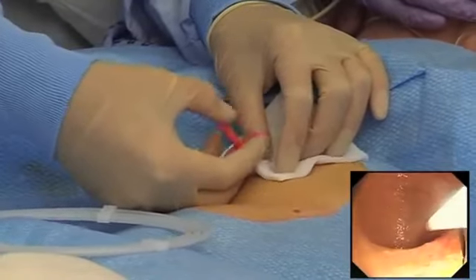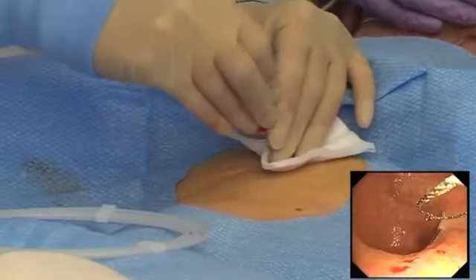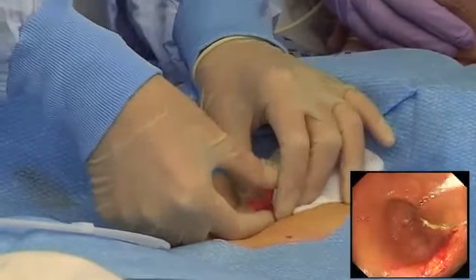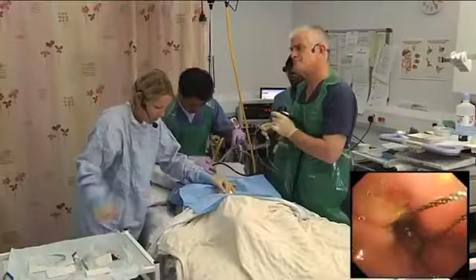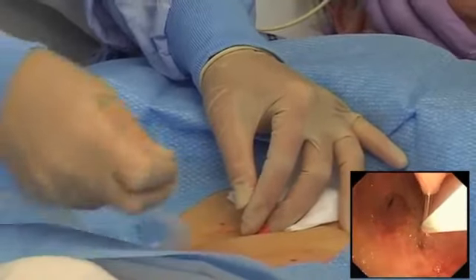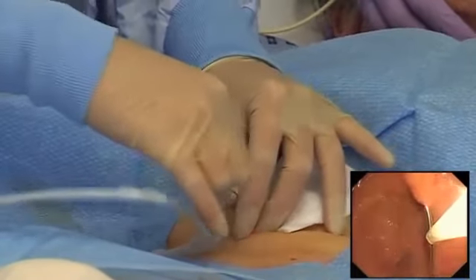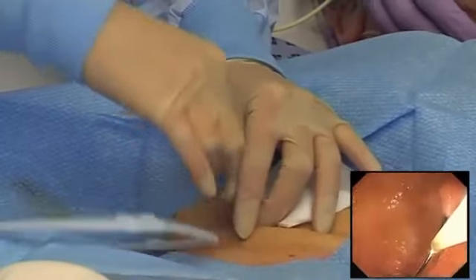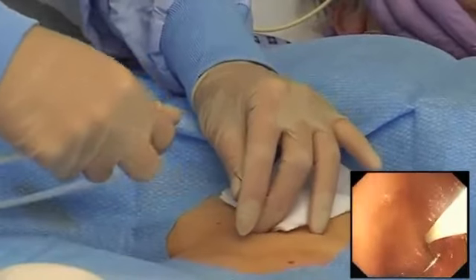Okay. Just going to open the snare, pull back a bit. Yeah, can you just angle it slightly? There, that's it. I'm just going to put the snare over the trocar now. Okay, close. Okay, I'm just going to feed the wire. Okay, I'm just going to hold that there. It's actually pulling the needle back towards me, and I'll wait for the wire to come out. Okay, that's out.